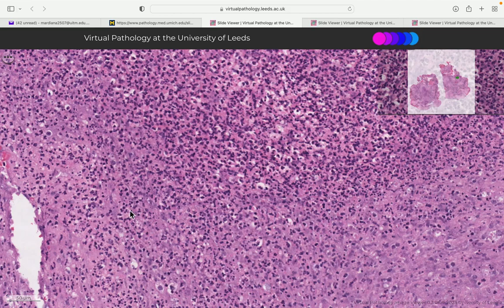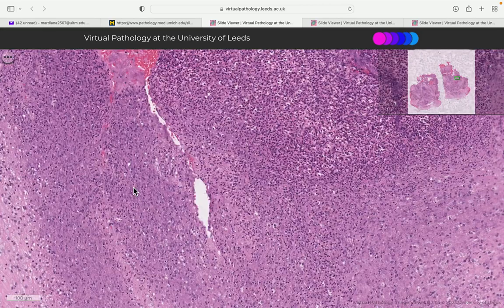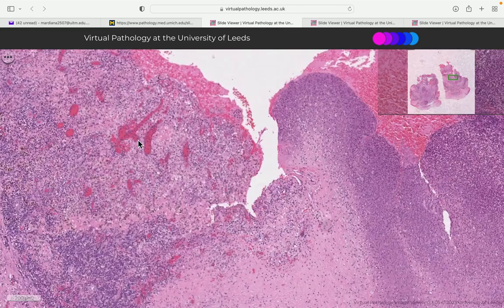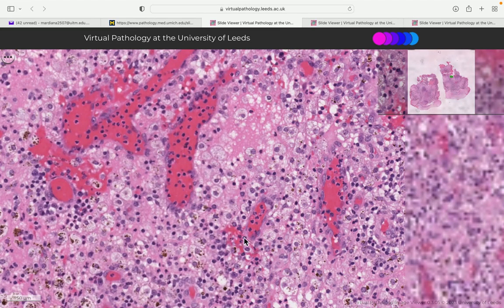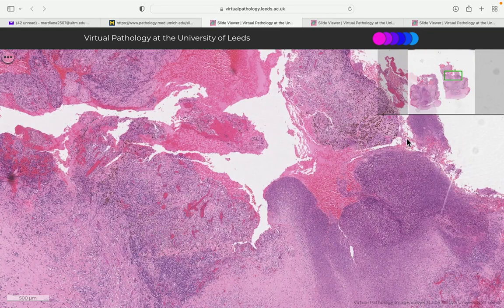This is the content of the abscess, and an abscess is usually surrounded by granulation tissue. Granulation tissue is angiogenesis, so you see a lot of blood vessels, small blood vessel formation. We'll see that in the last case. Okay, so that's one piece.